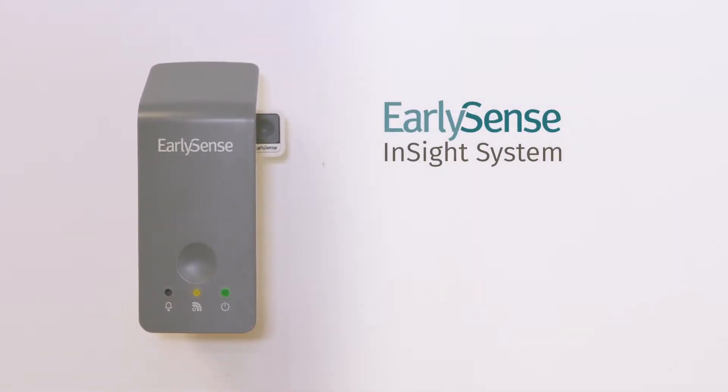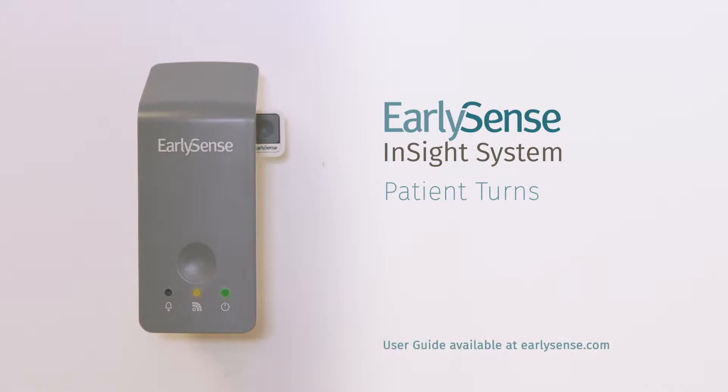Welcome to the EarlySense tutorial video. During this video, we will demonstrate how to acknowledge and document a patient turn. For any elaboration on how to operate the EarlySense system, please refer to the relevant user guide provided upon installation or online at EarlySense.com.